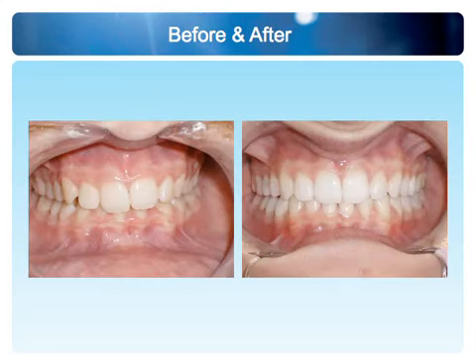And as the patient bites down, we have level, aligned and derotated the entire case. And when we look in there, we have upright posterior segments, not leaning in, causing interferences and poor occlusion. So, as we establish the width and the arch form, we also establish the canine guidance. And if you look at the left picture here, you can identify that the canines are not in the position for guidance. And yet, over here on the right picture, they are.